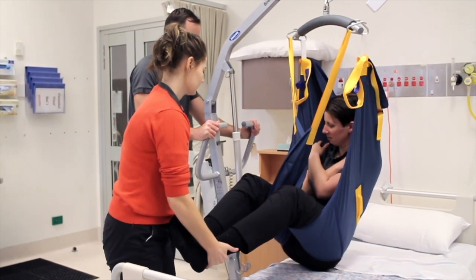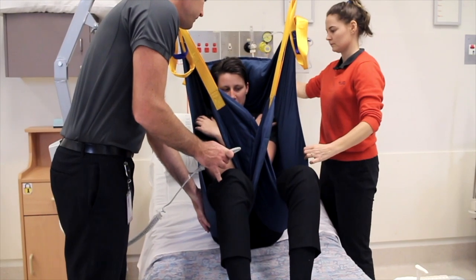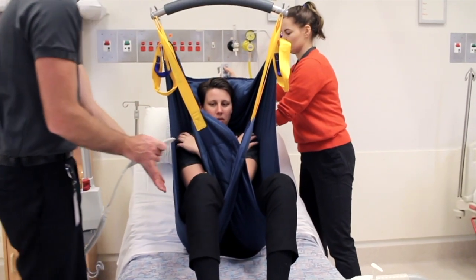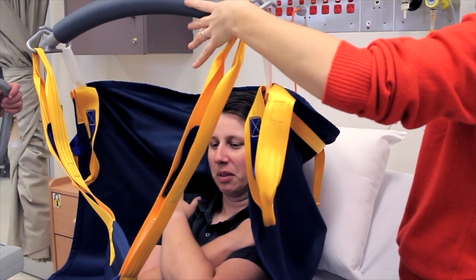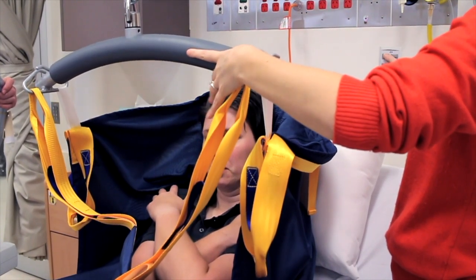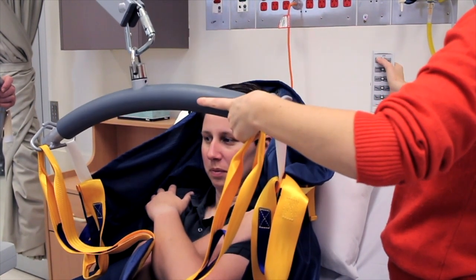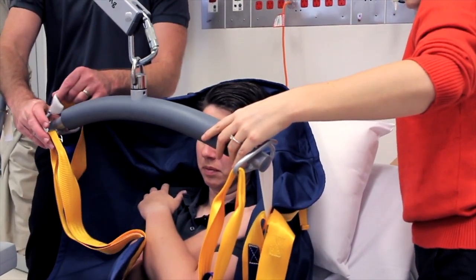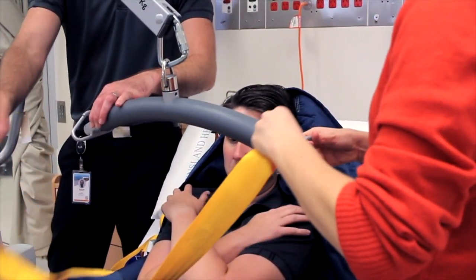Once they're positioned in the centre of the bed or the desired position, we'll let their legs down onto the bed and progressively lower the client or consumer onto the bed until all the pressure is off the yoke frame sling connectors from the boom. You'll see here that the pressure is coming off the connectors where they can be easily removed by the two therapists or staff members. Making sure one person holds the boom at all times to avoid any risk of it swinging around and hitting the resident, and working as a team to communicate during the task to each colleague as well as to the resident or consumer.